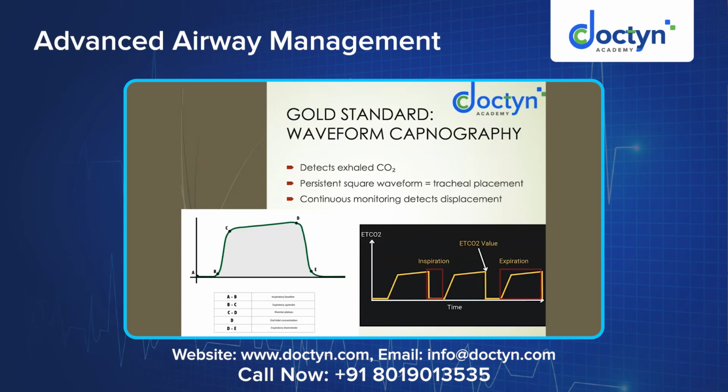If it is in the trachea, there will be continuous release of carbon dioxide from the lungs into the exhaled air, so there will be a continuous EtCO2 reading in endotracheal intubation. If it is an esophageal intubation, the carbon dioxide levels usually come down gradually and sometimes become zero. That is a confirmation that the endotracheal tube has accidentally been inserted in the esophagus. Continuous monitoring detects displacement. A minimum of 5 waveforms is required to confirm endotracheal intubation.